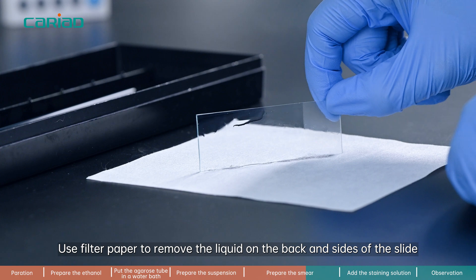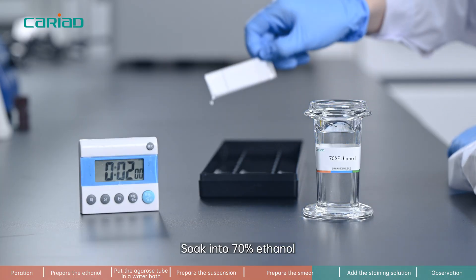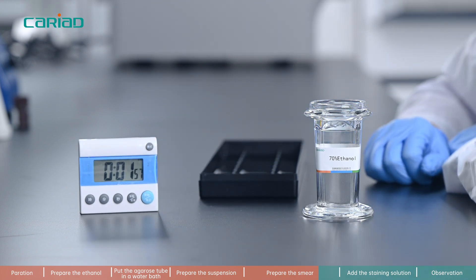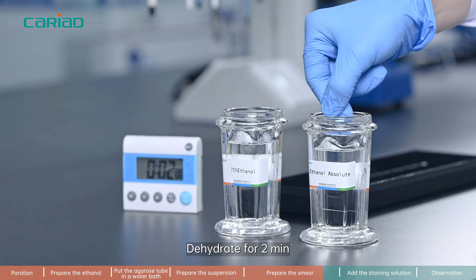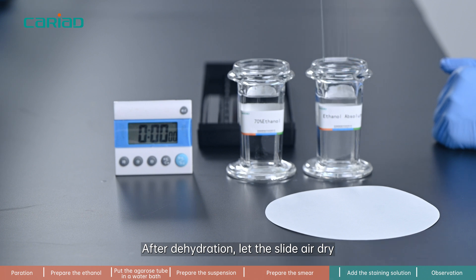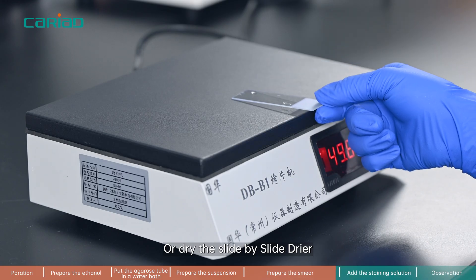Step 8. Use filter paper to remove the liquid on the back and sides of the slide — do not touch the specimen area. Soak into 70% ethanol and dehydrate for 2 minutes. Then soak into absolute ethanol and dehydrate for 2 minutes. After dehydration, let the slide air dry, or dry the slide using a slide dryer.